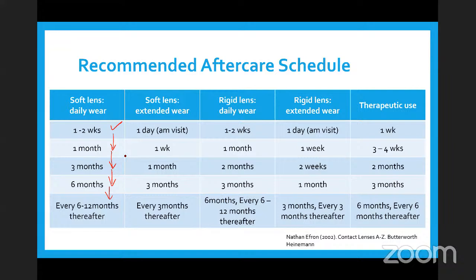You follow this up, right? When there is something which you find out during an aftercare, it will be case-to-case based what you're going to follow. So make sure that you have that in mind. And this table also shows you not only daily wear, but if you see the second part, it shows you extended wear, rigid gas permeable lenses, RGPs, and also therapeutic lenses. So this recommended aftercare schedule is what I usually also follow.